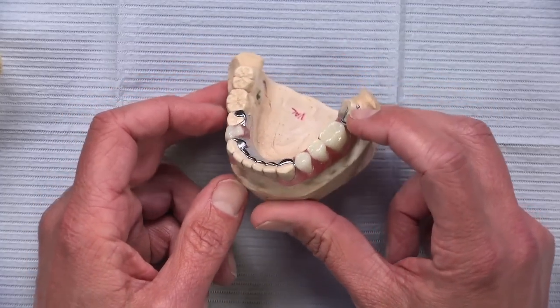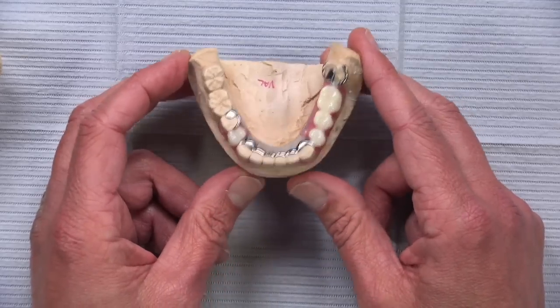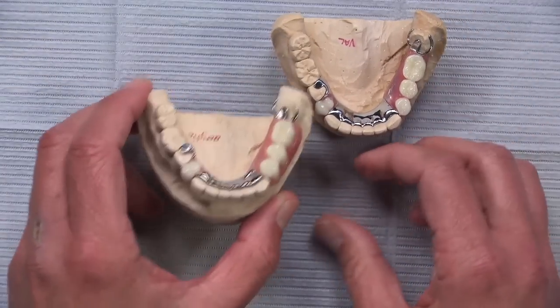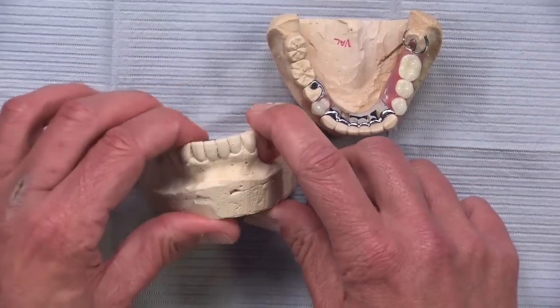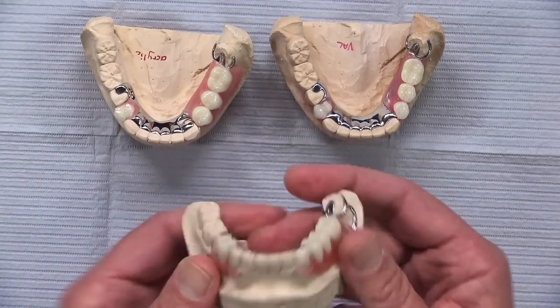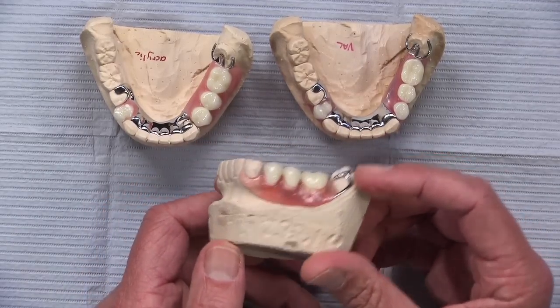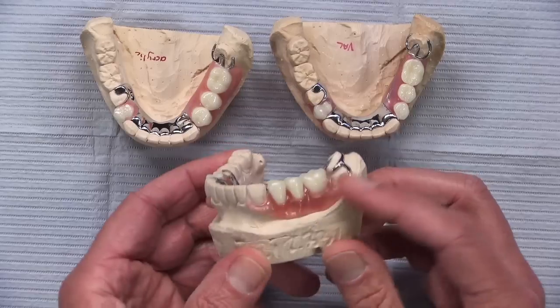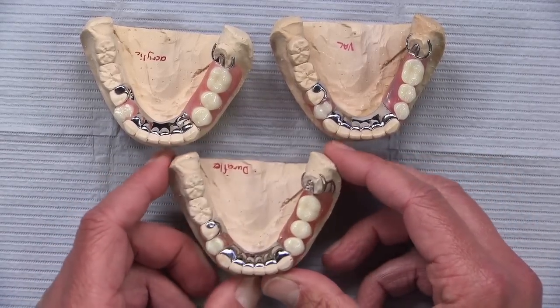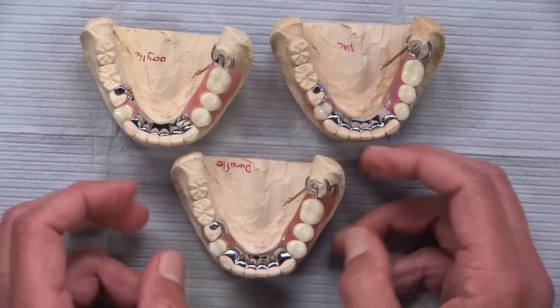This happens to be a cast metal base, and we have Valplast. I just marked a little "val" there so we can keep in mind which one that is. That's Valplast. Here's that same case being seen with metal and with acrylic. And the same case with the material that we looked at a few weeks ago, something called Duraflex, and it has some nice benefits as well. So we're going to look at these different materials just to give you an idea of how we might do an identical case a little differently.